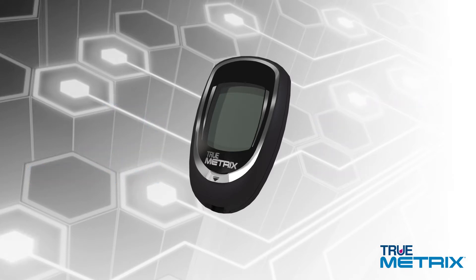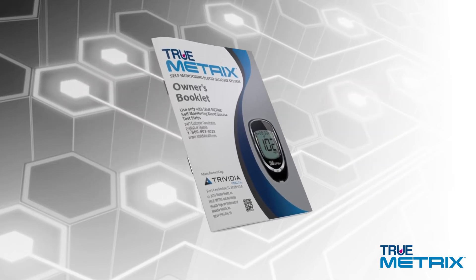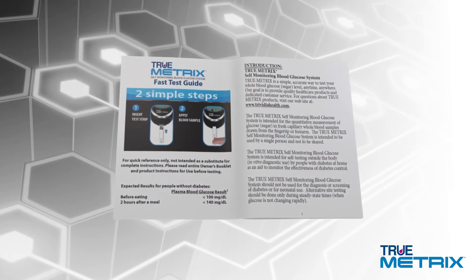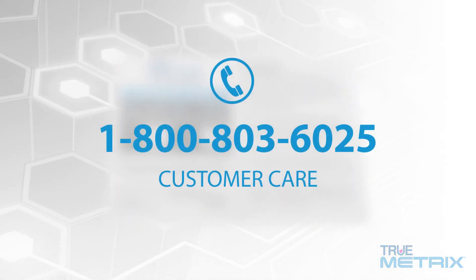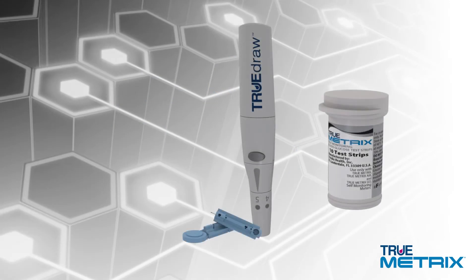This presentation is designed to help you test with confidence and familiarize you with the TrueMetrics meter and test strips, and demonstrate how to perform a blood glucose test. If you choose to use the other helpful features of the system or want a more comprehensive review, please see the owner's booklet or call our customer care department at 1-800-803-6025. They will personally assist you with questions you may have about the TrueMetrics system or help you perform a blood glucose test over the phone. Let's start by showing you how easy it is to perform a blood glucose test.